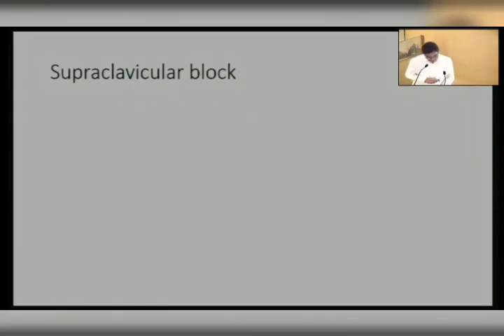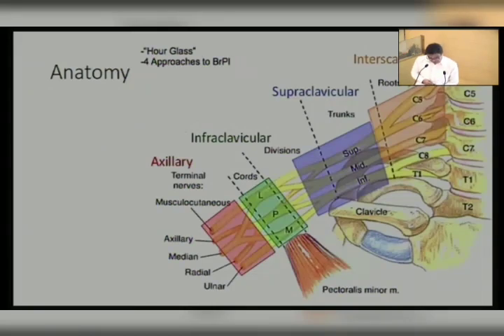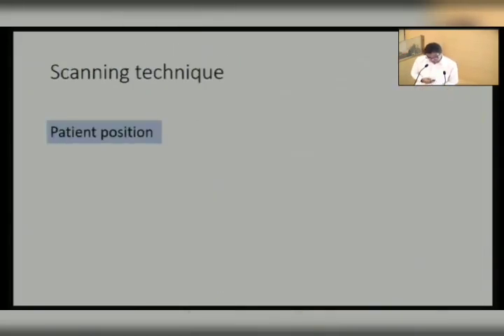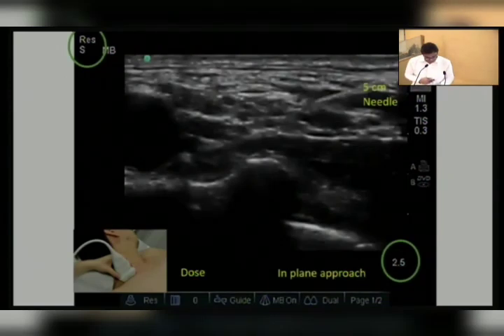Okay. So the next block is supraclavicular block. We will see the scanning later on in all the brachial plexus. So the next block is supraclavicular block, and as we all know, it is a trunk or division level block, and the scanning is almost the same as interscalene, in supine and lateral positions. The usual machine setting is also almost the same.